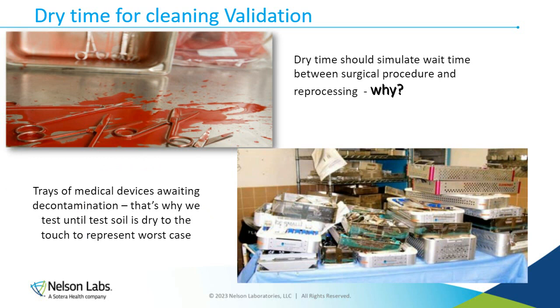Now, dry time for cleaning validations is something that has been discussed very historically. I started these validations 20 years ago, and dry time was different to what it is now. What we did before was we just placed a wet towel over the device and kept it moist, so it's moist when it goes down for reprocessing. Now it's a different story.